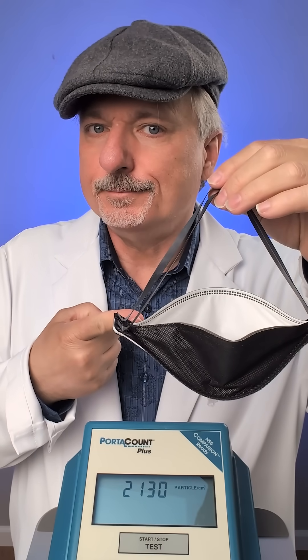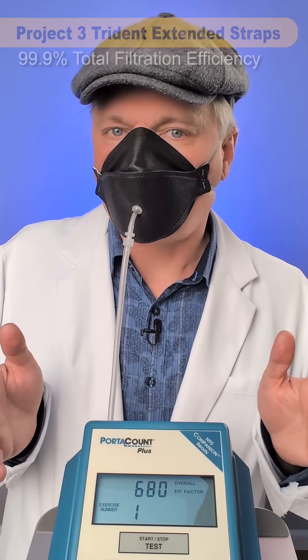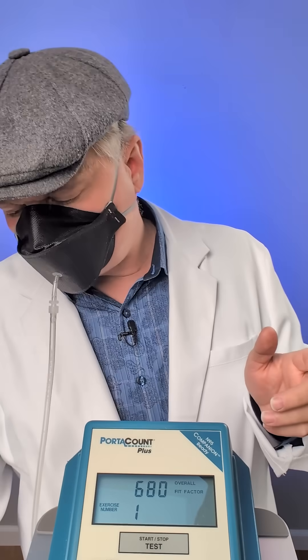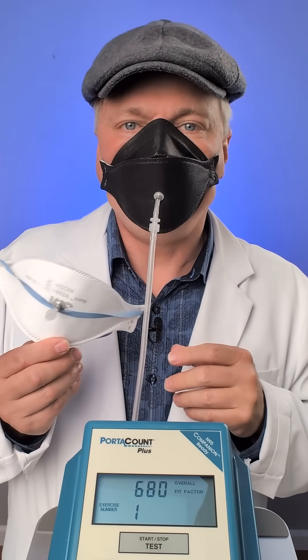Starting with the extended length version: 680 is a very good score — 680 times cleaner inside the mask of submicron particles. That's actually better than I often get with these 3M Auras, but these straps are a little bit tight for comfort, even though this is the extended version.